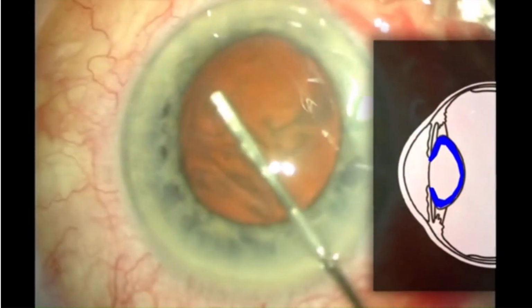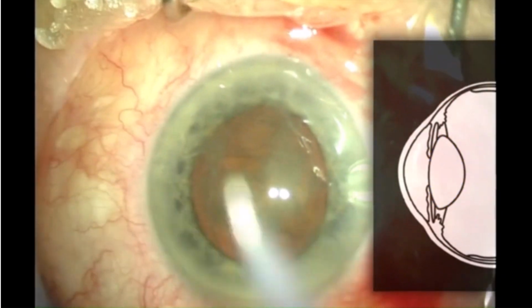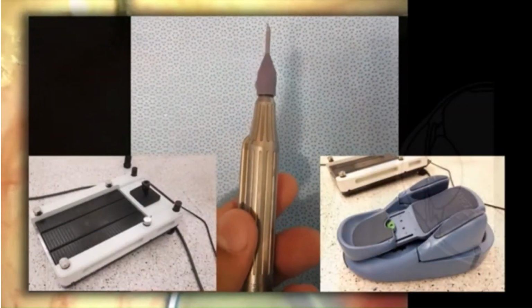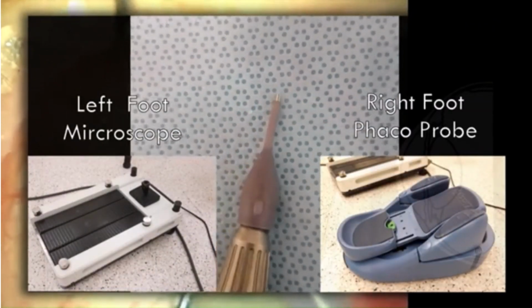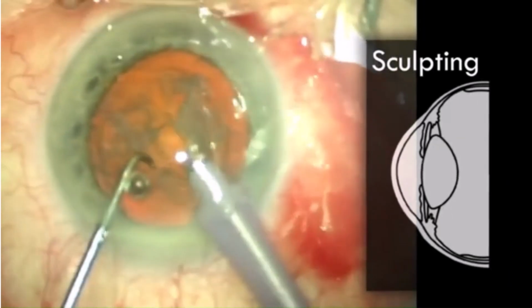Hydrodissection. Nucleus is separated from the cortex by injecting fluid under the anterior capsule. See, they're showing you the phaco tip, right? And that is the entire control system of phaco.